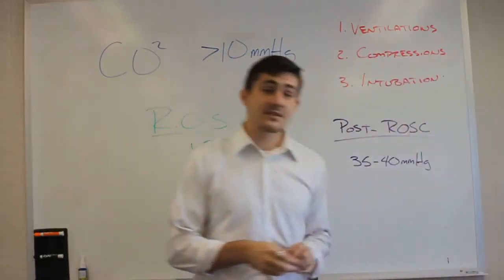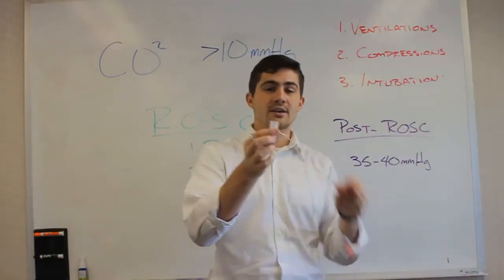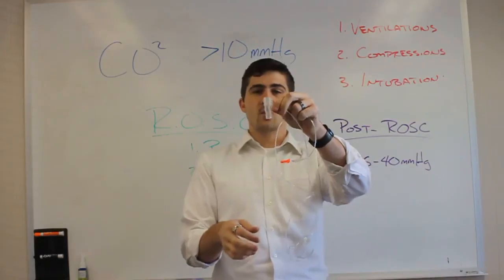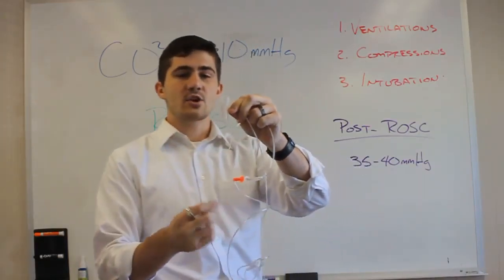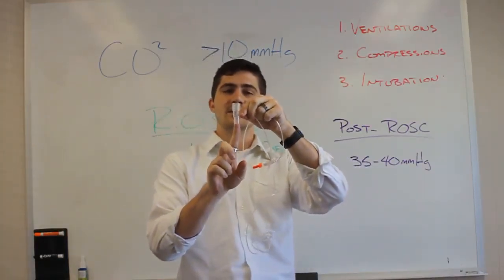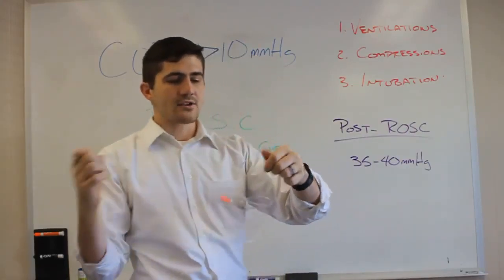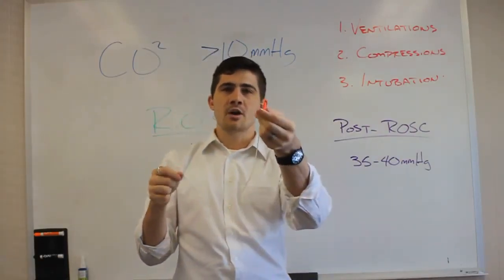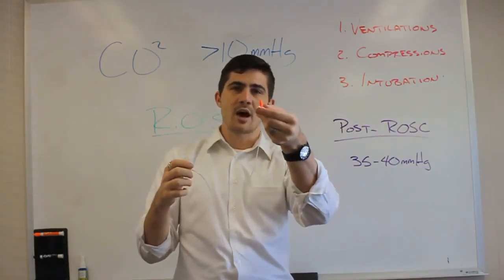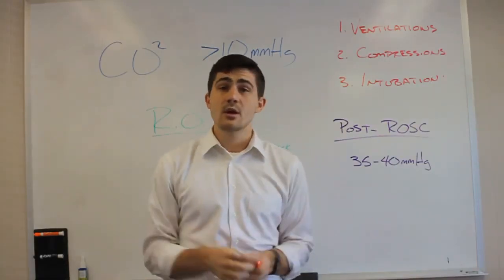For those of you who haven't seen it, this here is the device used for waveform capnography. It's going to plug into your ET tube, and then your BVM goes in on the top. And it's a little cord that'll either plug into your monitor or into the waveform capnography unit. And it just reads your CO2 levels.